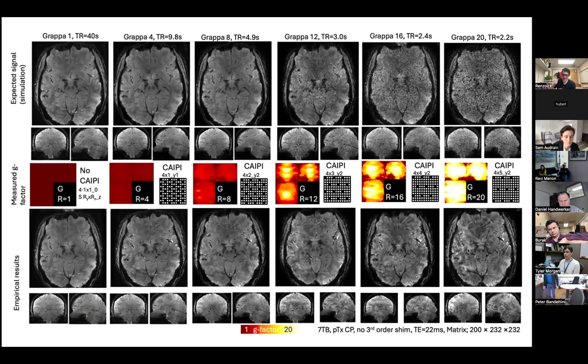It doesn't really look like the simulation though, right? We don't have all this salt and pepper noise that we would expect if we were starting from a thermal noise limited data set. This data is still completely unusable, right? But it's different than expected, which is always interesting and funny because then we can learn something and maybe improve something. And it gives us... Renzo, quick question, yes?